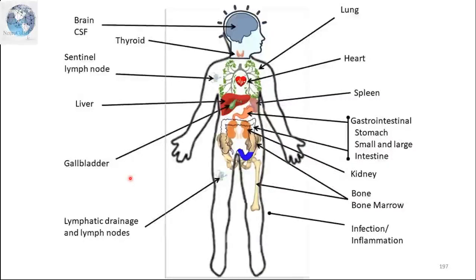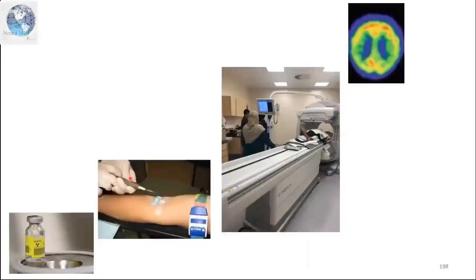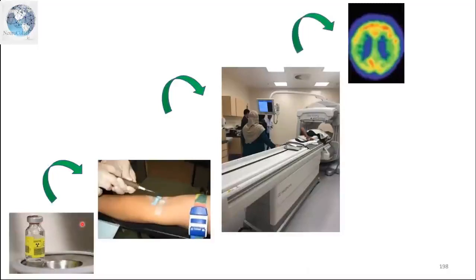For the bone, you can use MDP, methyl diphosphonate. So phosphonate ni pergi bone seeking, so they tag to the bone. Kidney, DTPA, MAG3, those are examples. Okay, the DMSA. So these are various radiopharmaceuticals. So when we inject this, okay, vial kat bawah ni, this is the bottle of technetium. We combine it with the cold kit specific to the different type of body part that we want to image. We inject it into the patient intravenous, and then we can perform the scan after the uptake time has taken place. And then we can acquire the image of specific organs, the function.